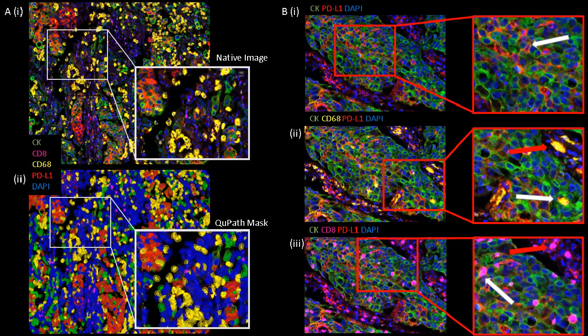As well, CD68 can be PD-L1 positive, and again, in the bottom right, we can see on the white arrow inside the epithelial nest, there's a CD68 positive, PD-L1 positive cell. We need to make sure that's completely discounted from the analysis because obviously that's not a PD-L1 positive cytokeratin positive cell.